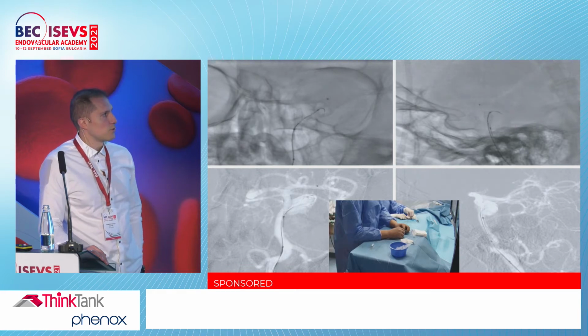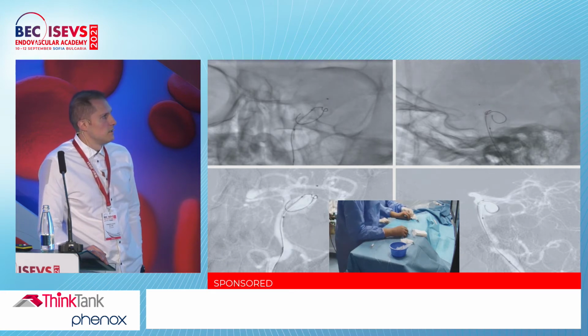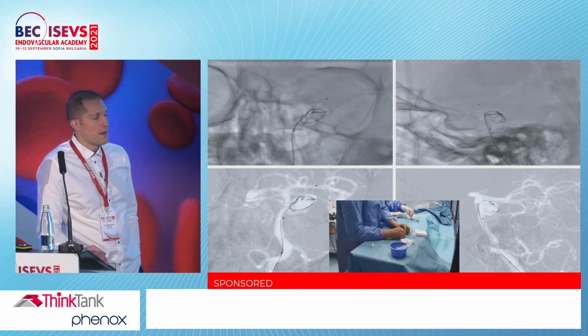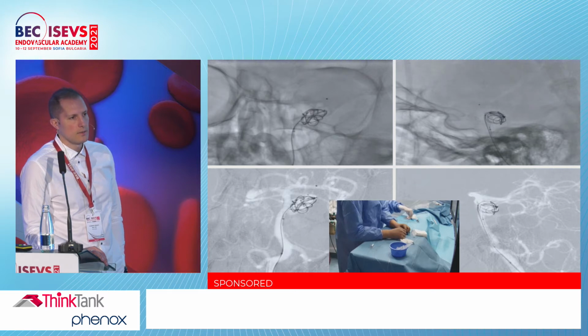So we stop here and start to coil. I didn't deliver the stent completely, so I wouldn't move or dislodge it during the coiling. I decided now to put the first coil. As you see, I didn't like the projection of the first coil, where it was going like a mid-basilar, so I tried to play with it. I used the protection of the half-sheathed stent. It's like a temporary stent for your coiling. So we are very careful, very gentle, with just one long coil, and we decided not to waste time staying with this half-deployed stent.